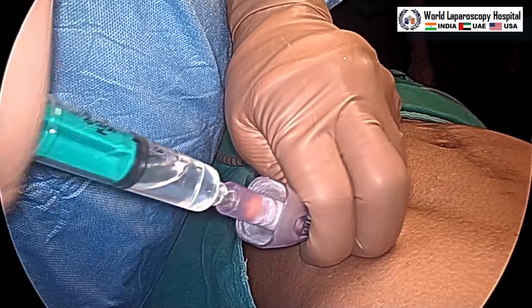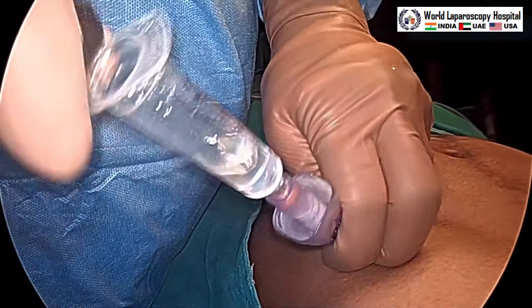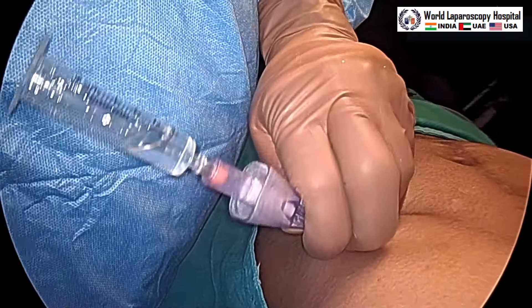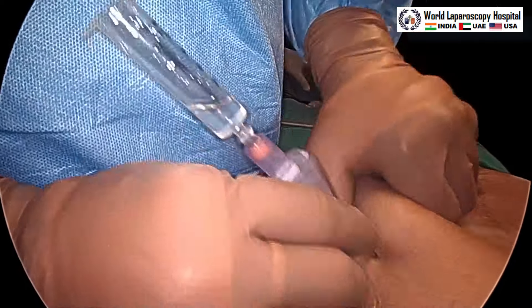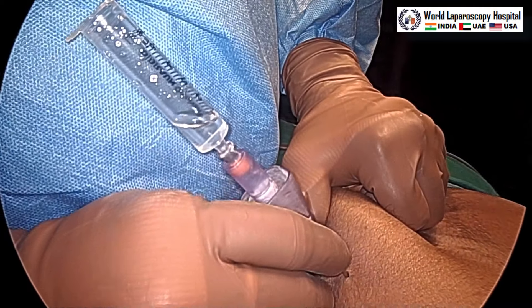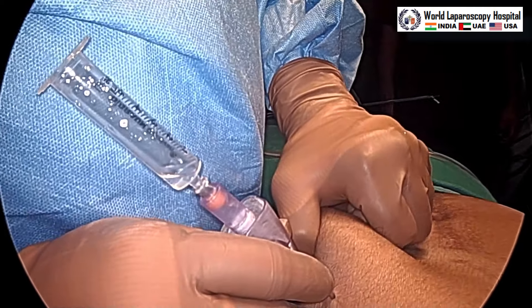Alternatively, you may do the plunger test. For that, you have to take the piston of the syringe out, and then as soon as you lift the abdominal wall a little bit, you will see all the fluid getting sucked in. That is the plunger test and is also one confirmation that we are inside the abdomen.